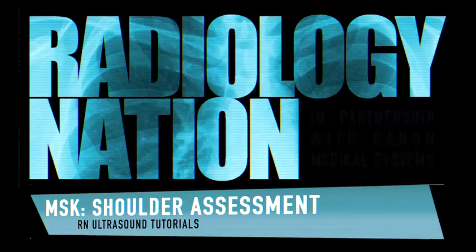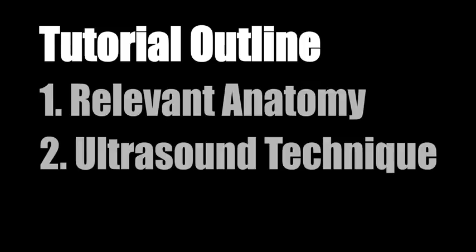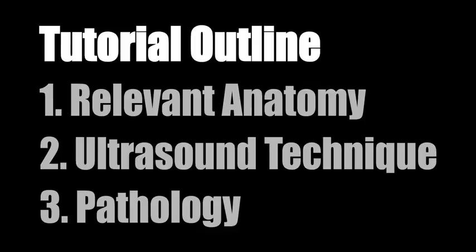Ultrasound is a fast and effective tool for the diagnosis of common shoulder diseases, in particular rotator cuff abnormalities and impingement. During this video we will start off with a review of the relevant anatomy, then demonstrate how to perform the ultrasound examination. Finally, we will end with a few examples of the pathology that you might see.